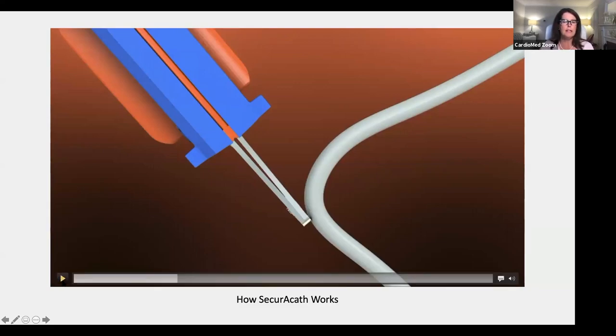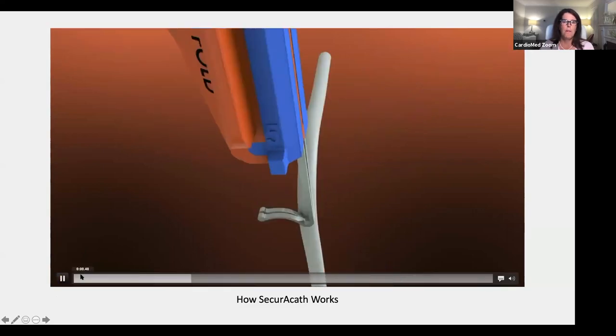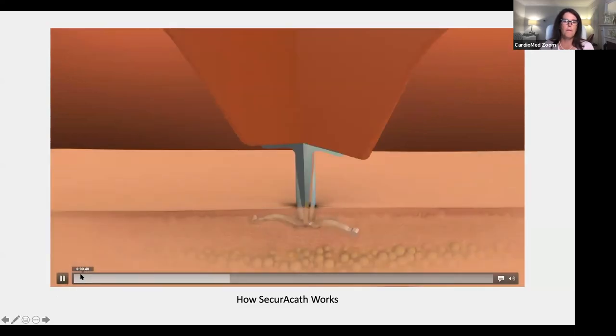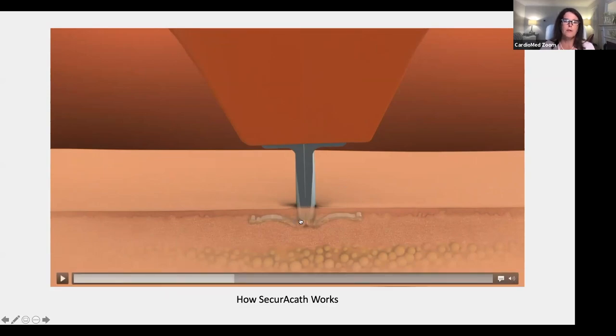So once the PICC is placed, again, the clinician will insert these nitinol feet through the insertion site. Then they will unfold the device. So you can see here there's two nitinol feet, and those feet are laser cut. They are rounded edges. There's no sharp edges that are going to cause harm to the patient. So those two feet are spread out in an L shape each side so that the device can't be pulled out.